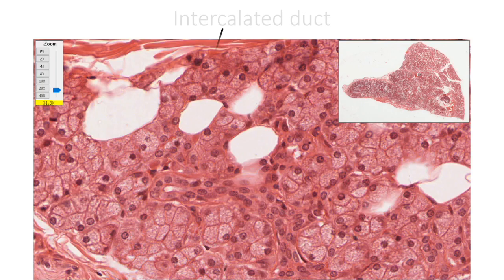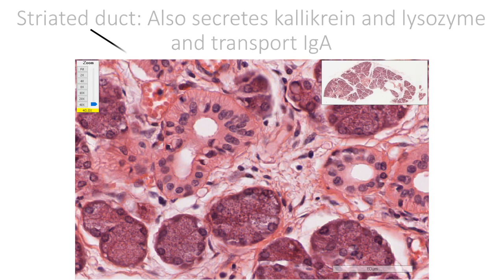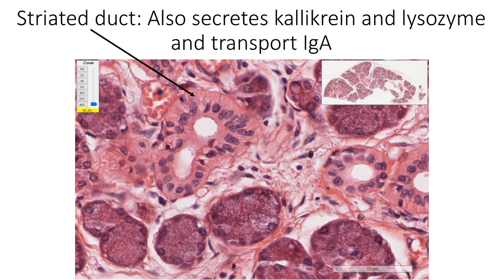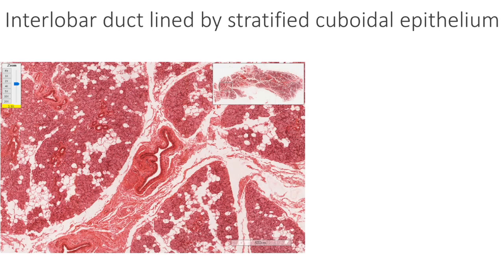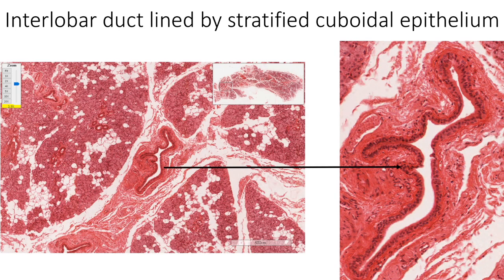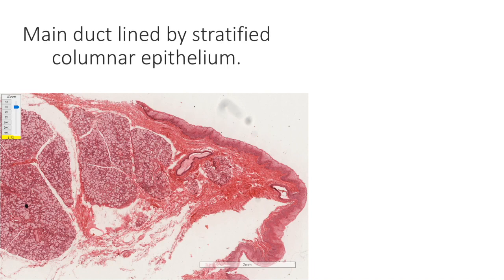You can see an intercalated duct here lined by cuboidal epithelium. Here you can see a striated duct lined by low columnar cells showing basal striations and centrally displaced nucleus. In addition to modifying the electrolyte content of the acinar secretion, the cells lining these ducts also help in secreting kallikrein and lysozyme and aid in transportation of immunoglobulin A. Here you are seeing an interlobular duct lined by pseudostratified columnar epithelium. In this section, you can see an interlobar duct lined by stratified cuboidal epithelium. Here you are seeing a main duct lined by stratified columnar epithelium.